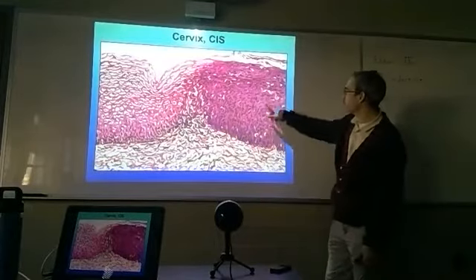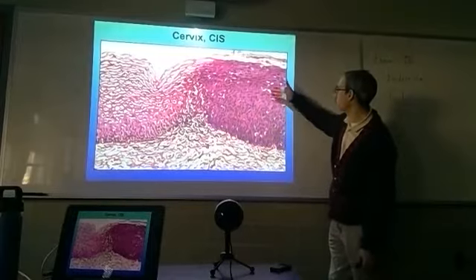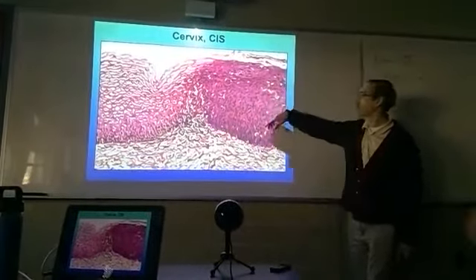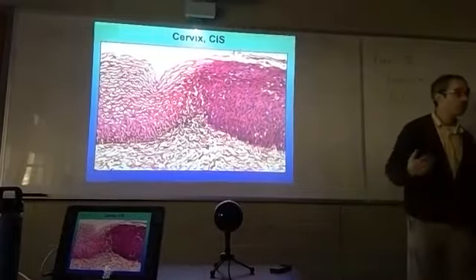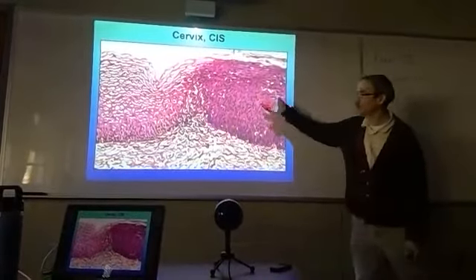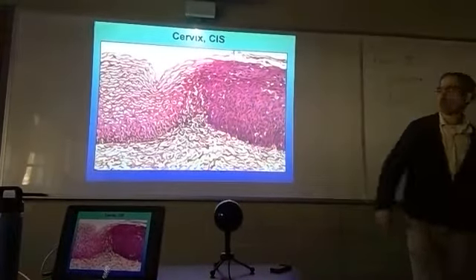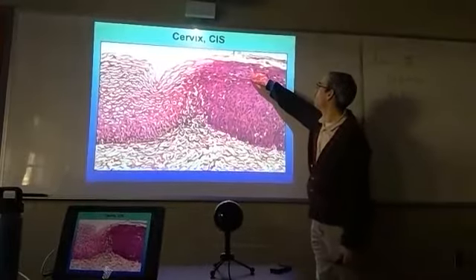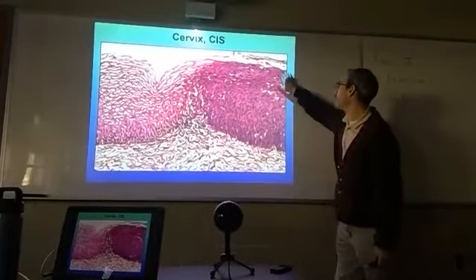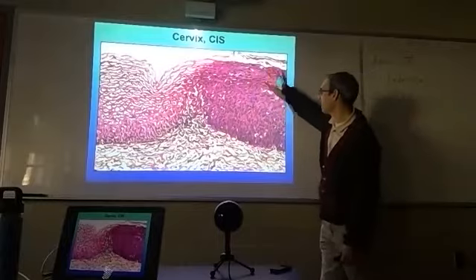But as the cells migrate upward, you'll notice they don't change their cytomorphology. Nucleus is still big in proportion to the cytoplasm. NC ratios are still very high. There's no sign of organization here. That persists all the way up to the superficial layer where you've got these big nuclei and very small cytoplasms. NC ratios are still very high.